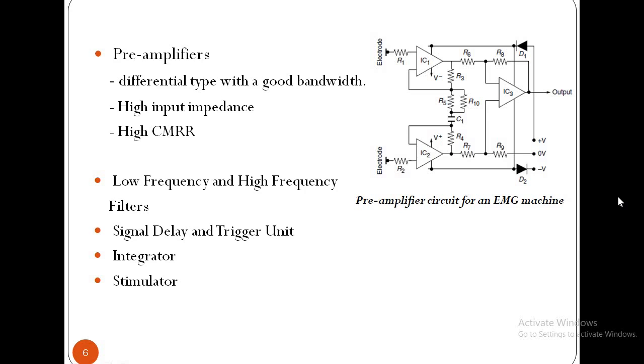Sometimes it is necessary to examine the signals from individual fibers of muscle tissue. For this purpose, special needles are available with a 25 micron diameter electrode surface and up to 14 pickup surfaces down the side of one needle. These 14 points are scanned sequentially to determine which point is acquiring the largest signal.